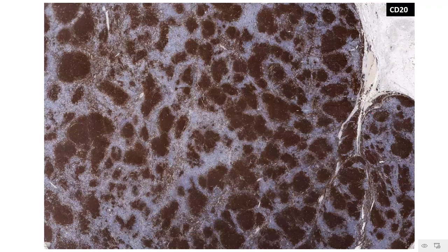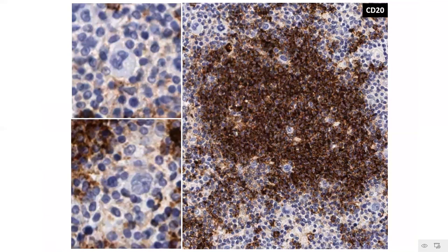Now, talking about the immunophenotype, at a very scanner view, you see that on doing CD20, the population is seen to be mostly B lymphoid cells within these nodules, right? You've got a very B cell rich background. But within this B cell rich background, you see that these large atypical cells, along with those cells which look like the Reed-Sternberg cells, are negative for expression of B markers like CD20. Again, observe in this particular case, there is a halo of cells which are also negative for CD20 around the Hodgkin-Reed-Sternberg cell, meaning that on doing CD3, you are most likely going to get that characteristic collarette around these atypical cells, just like you saw in the case of NLPHL.